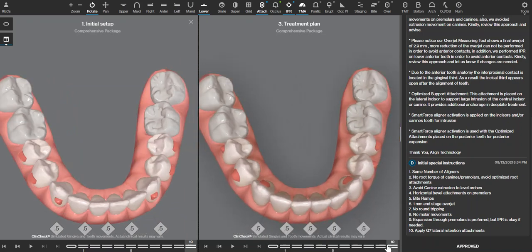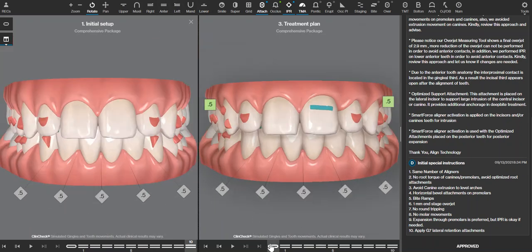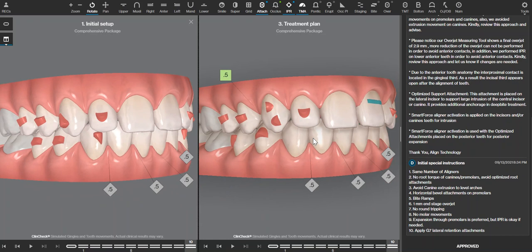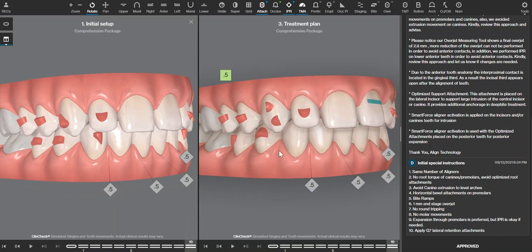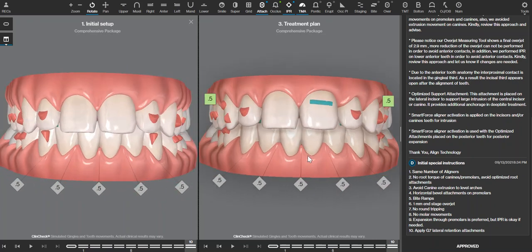With only 10 aligners, the patient should be able to go through this treatment pretty quickly. So if any additional aligners are needed, then it can be focused on just whichever movements didn't happen as well, and you'd be surprised. Sometimes those things can work out. But then for this patient, the other thing I would add would be an anterior C-chain to help ensure that those spaces are completely closed, as sometimes space closure can lag behind as well. So those are just some things that may need to be added in a refinement, but with good retention on the arch, which we have, then a lot of other movements can be executed very nicely.